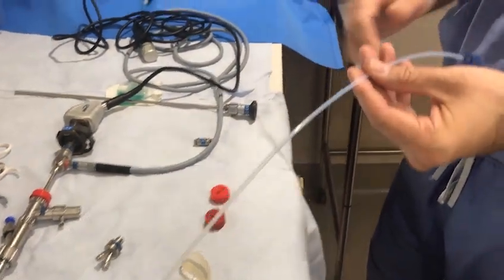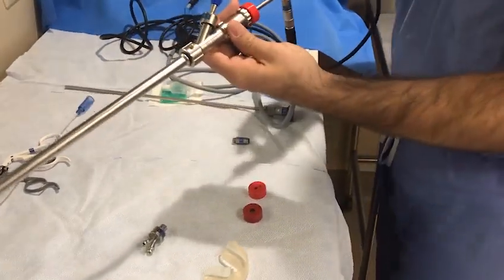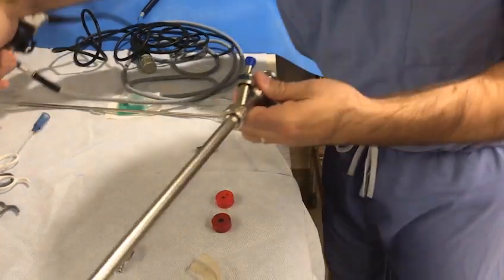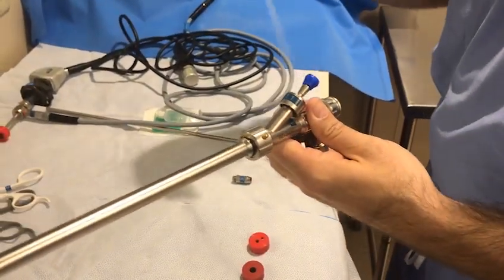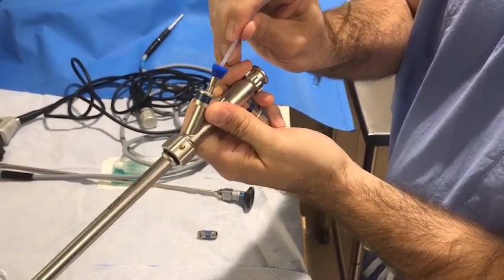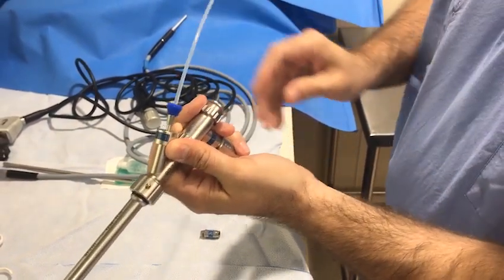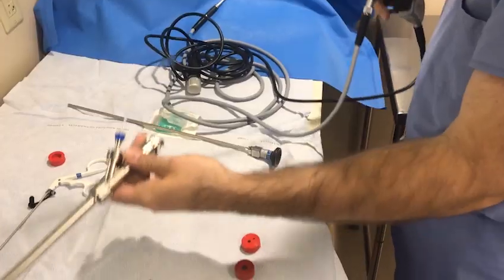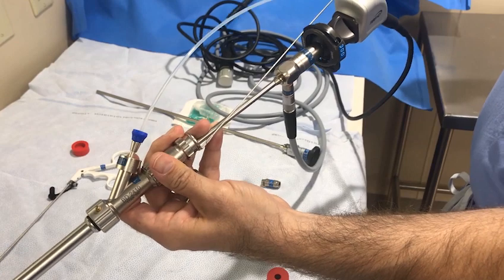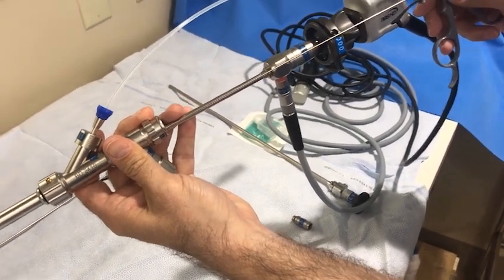This is the suction catheter. If you are using an open system as with jet ventilation, you will remove the silicone red cap and insert the telescope and gray-handled forceps into the bronchoscope. The suction catheter can be inserted into the single accessory port, or it can also be inserted into the proximal portion of the bronchoscope along with the forceps and telescope if desired. This is the entire assembly for an open jet ventilation system: suction catheter, telescope, and gray-handle forceps.